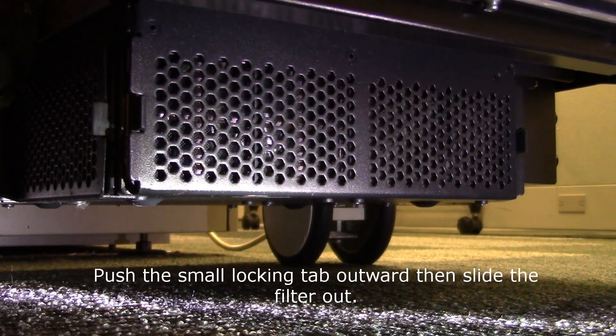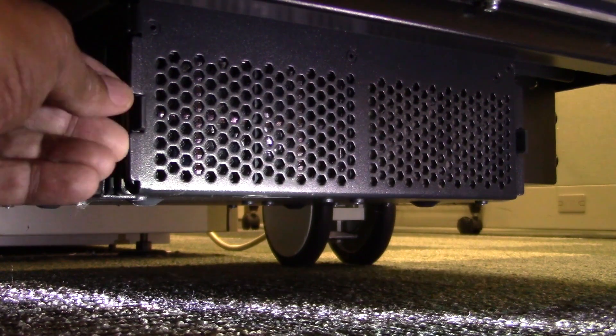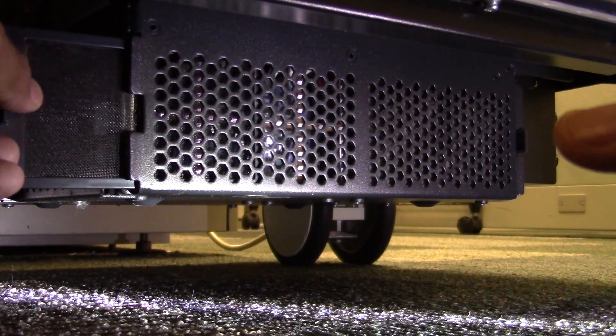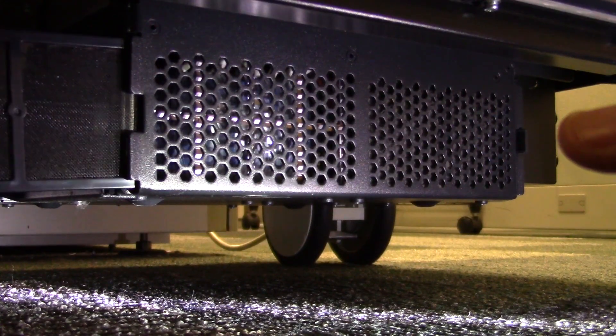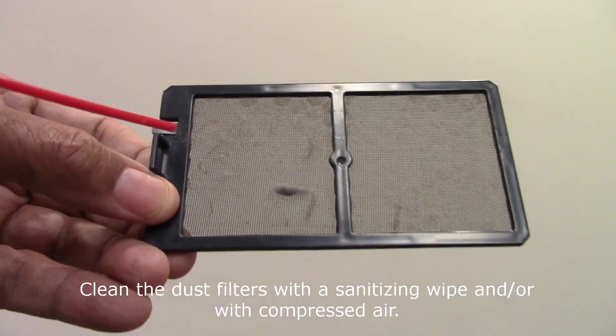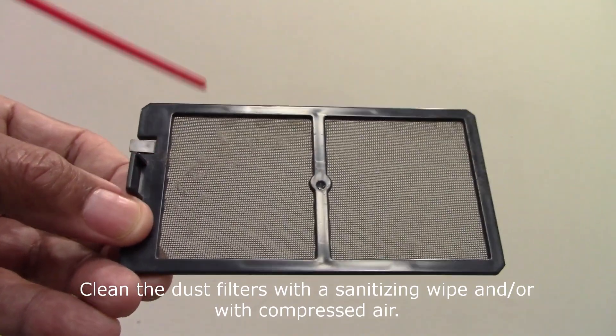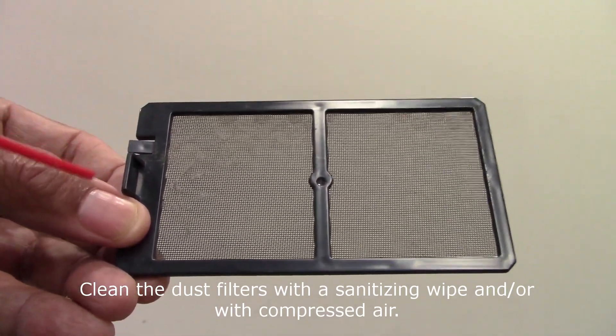Push the locking tab outward, then slide the filters out. Clean the dust filters with a sanitizing wipe and/or compressed air.